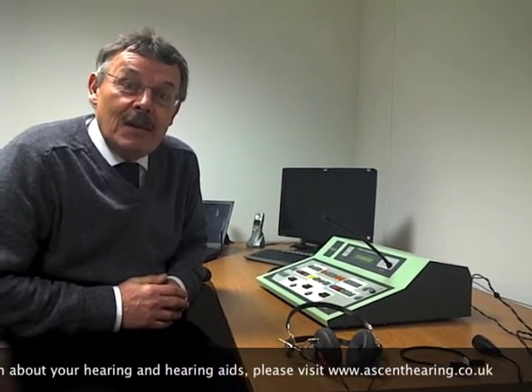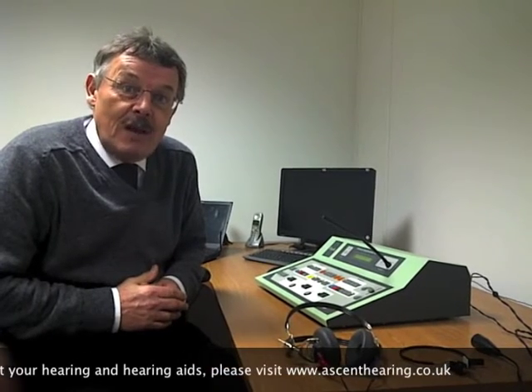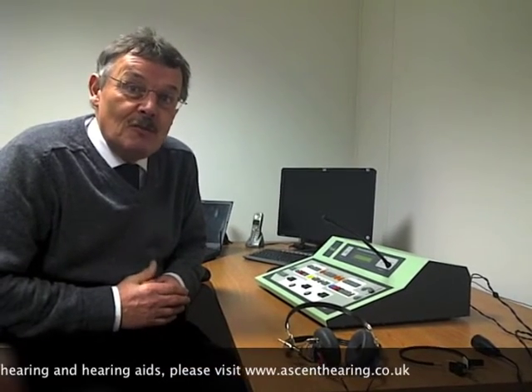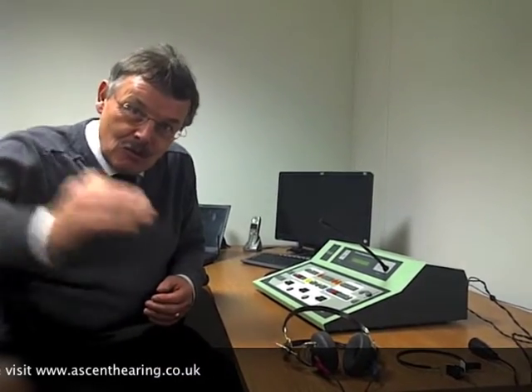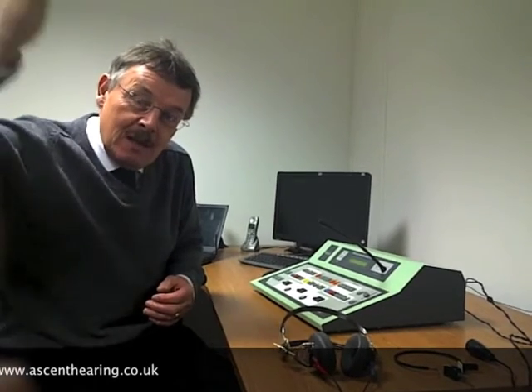And the test is carried out across the speech frequency range, normally between 250 Hertz or cycles per second to 8,000 Hertz or cycles per second. And at certain stations along that track of frequencies, the test drops in, so 500, 1,000, 2,000, 4,000, 8,000, and checks whether or not the tone is heard.